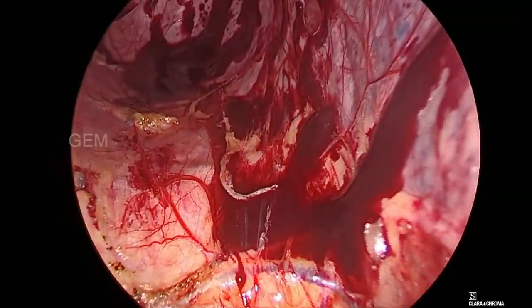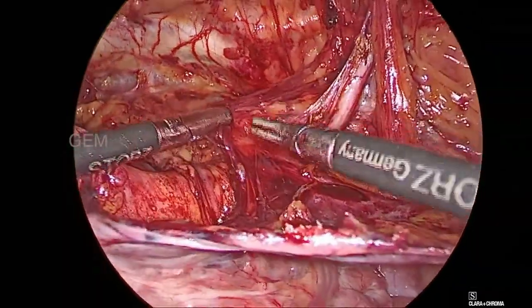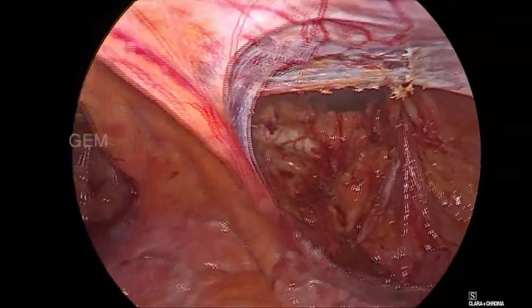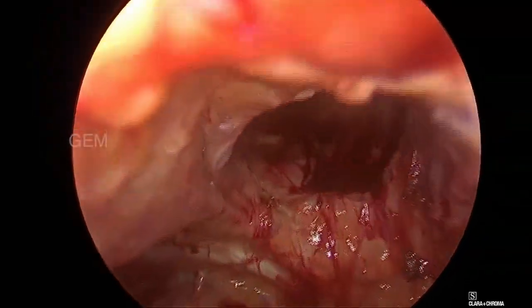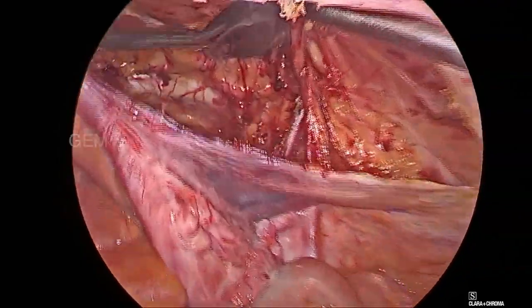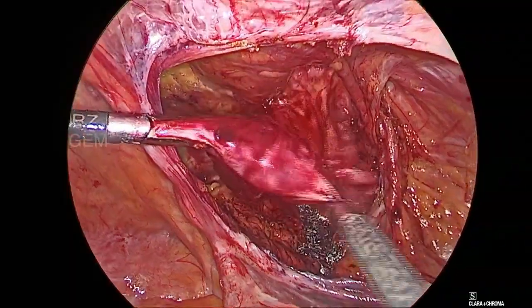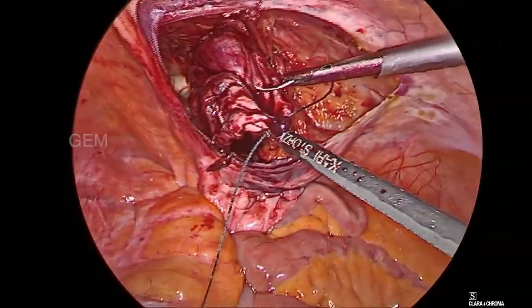If you leave without plicating, there is a high chance that it will form a seroma and the patient will not be satisfied. I have requested the assistant to push the pseudo-sac into the defect. I have also placed an extra port for the camera person to hold.